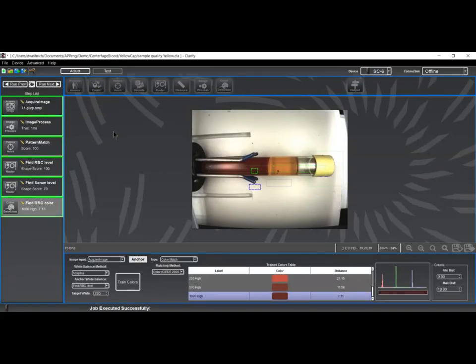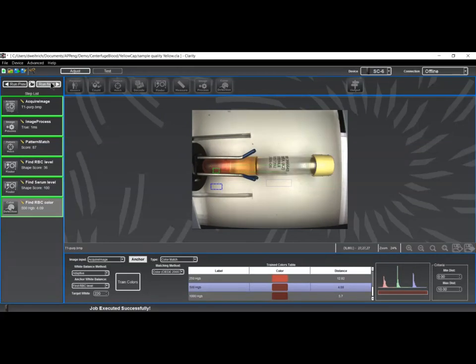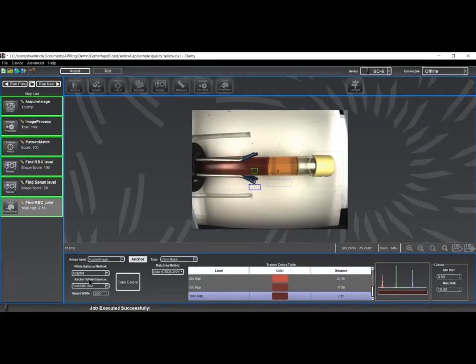Now we'll get into the aspect of color measurement. In this case, I want to measure the color of the blood area, the red blood cell area, and I want to measure the color of the serum area. What I've done is I've put a region of interest for measurement. I've moved it off to the side a bit to avoid this area here of specular that occurs in pretty much every sample picture. The blue box that's moving along with my color sample area is the region of interest applied for my white balancing processing that adjusts the sample color to compensate for the illumination intensity or shading variation that happens across the different areas where my sample area is being taken.